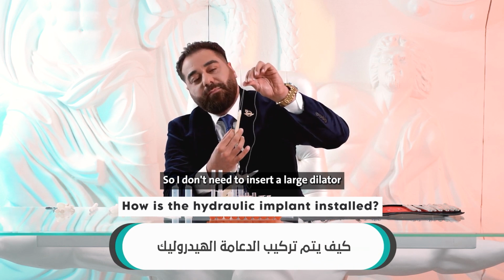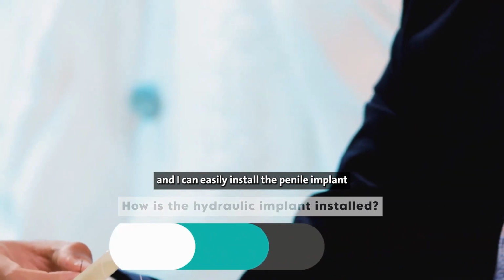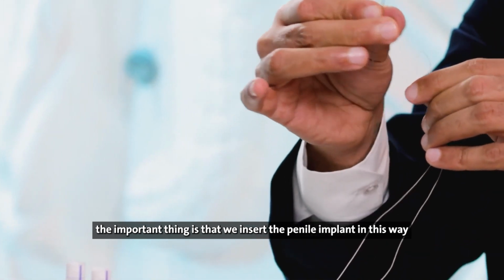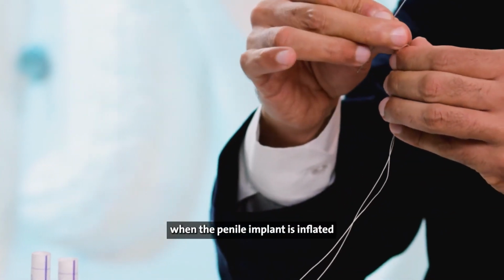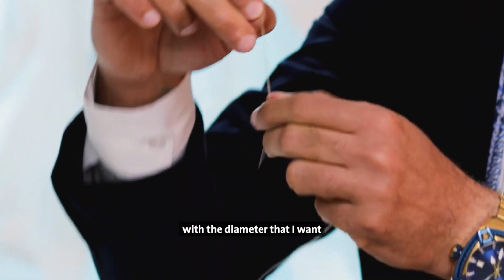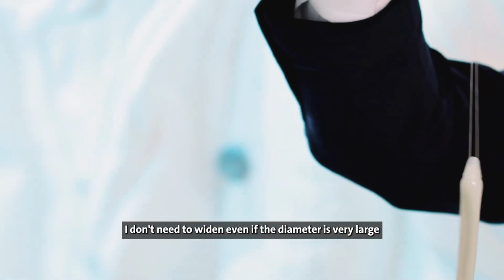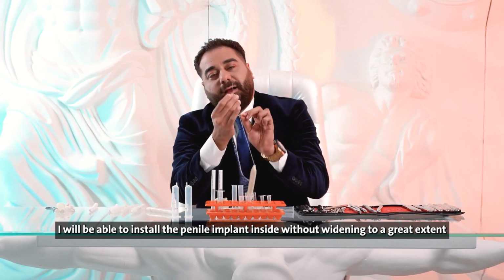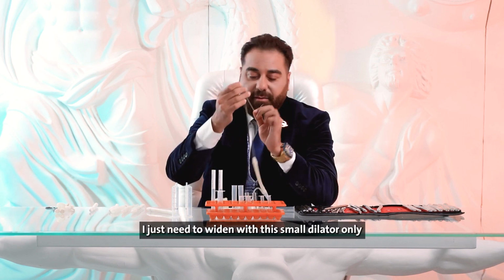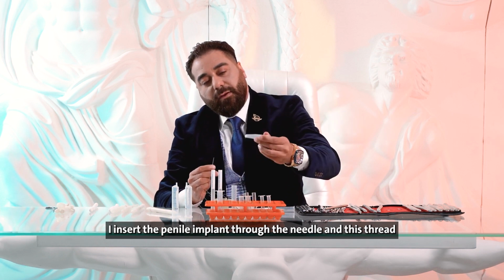So, I don't need to insert a large dilator. It's enough for me to have this needle inserted and this thread, and I can easily install the penile implant. Alright, the important thing is that we insert the penile implant in this way. After that, of course, when the penile implant is inflated, it starts filling the cavernous body, as you can see, with the diameter that I want. So with the hydraulic penile implant, I don't need to widen, even if the diameter is very large. I will be able to install the penile implant inside without widening to a great extent. Even if I need sizes 13, 14, or 15, I just need to widen with this small dilator only.